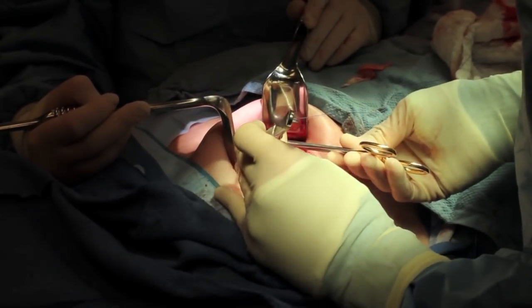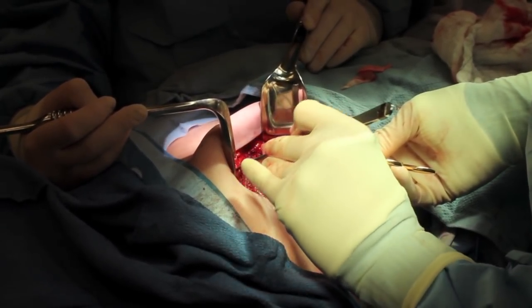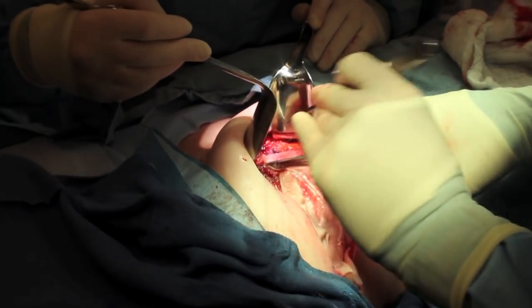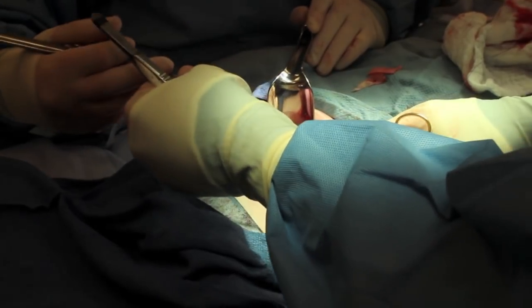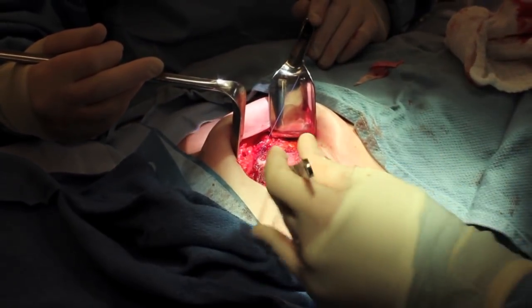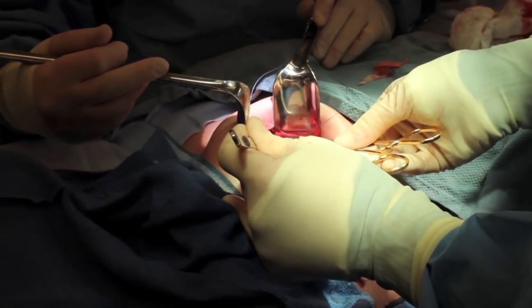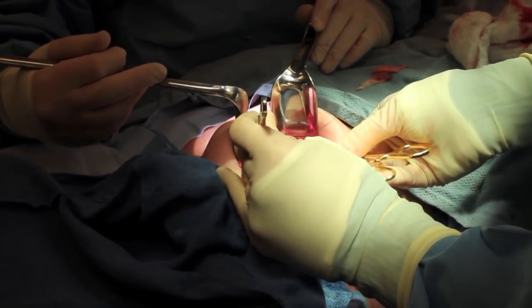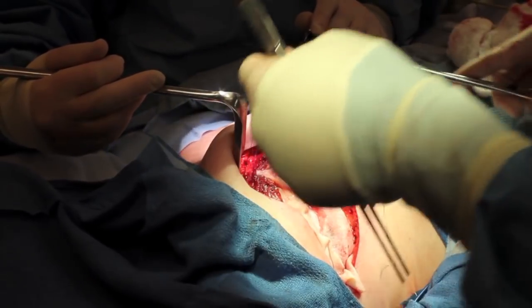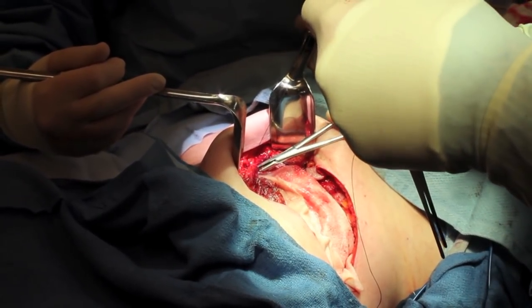Using a 2-0 Vicryl stitch in a figure of 8 fashion, the allograft is sutured to the pectoralis major muscle, starting medially along the pectoralis major muscle in a medial to lateral direction. Once it's sutured to the pectoralis major muscle, we'll suture it to the inframammary fold along the inferior side.